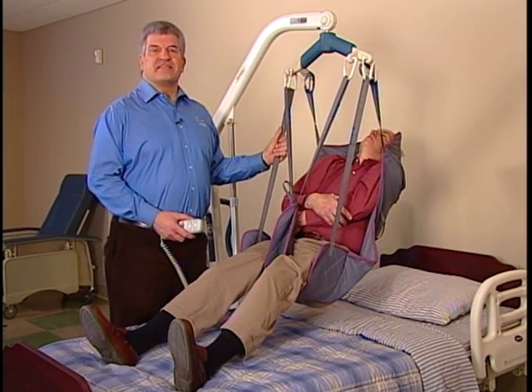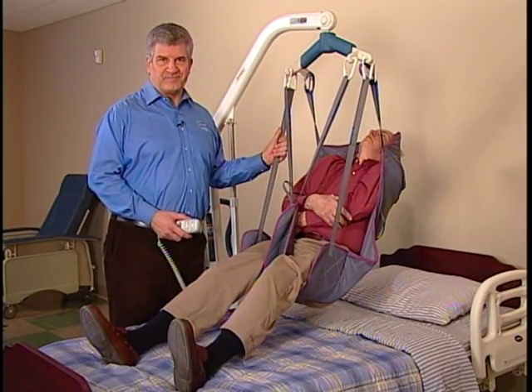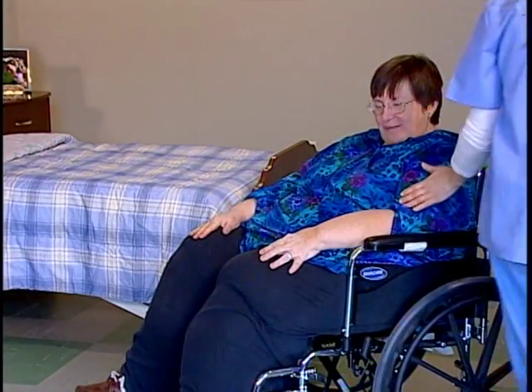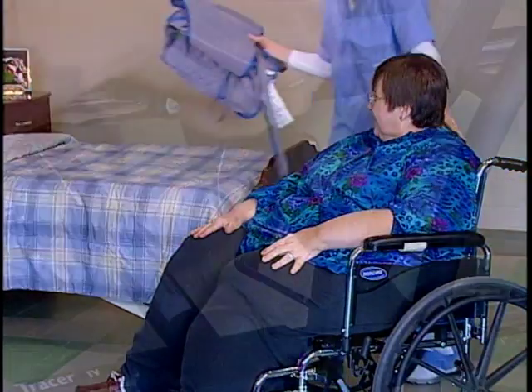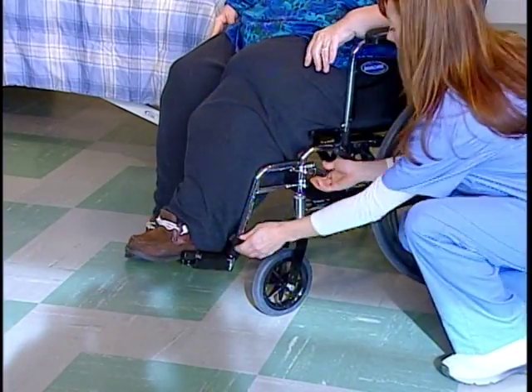Watch as a divided leg sling is used with the resident seated in a wheelchair. Before performing the lift, engage the wheel locks on the wheelchair and move the front riggings out of the way.